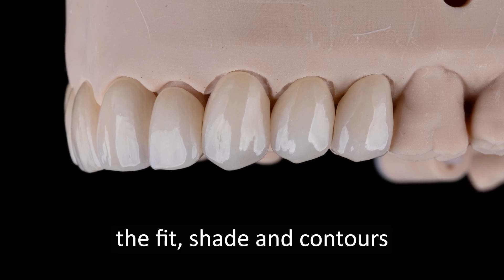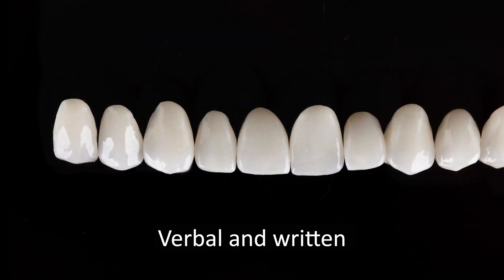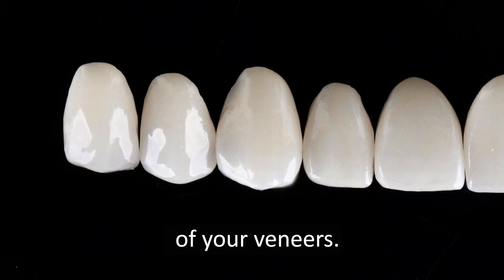After checking clinically the fit, shade, and contours, always get the patient's approval — verbal and written — prior to permanent cementation of your veneers.